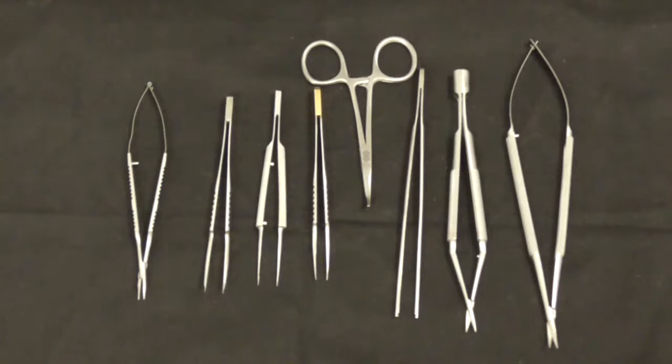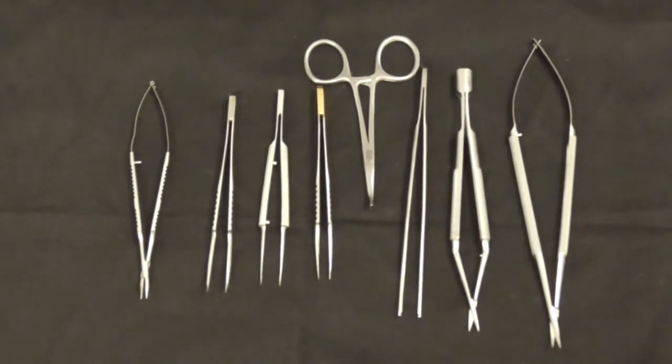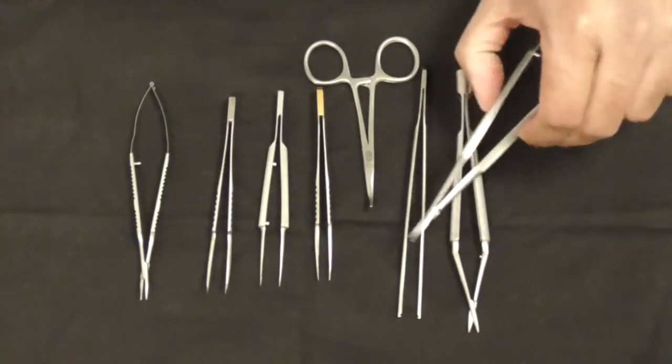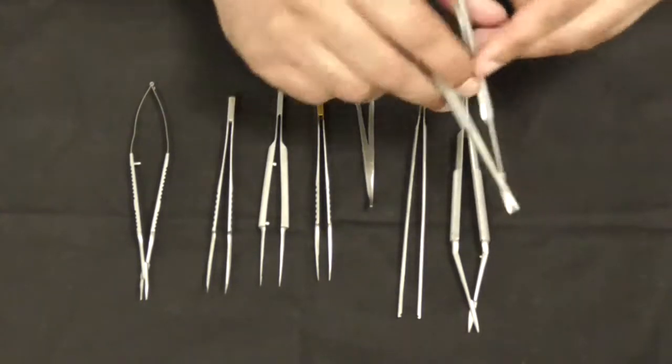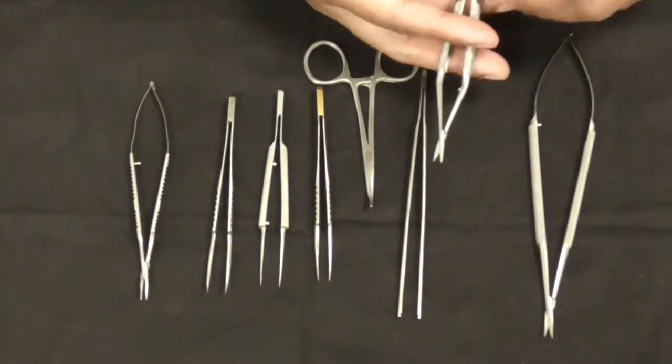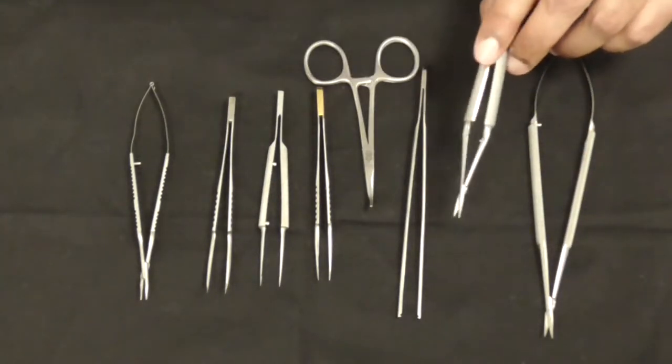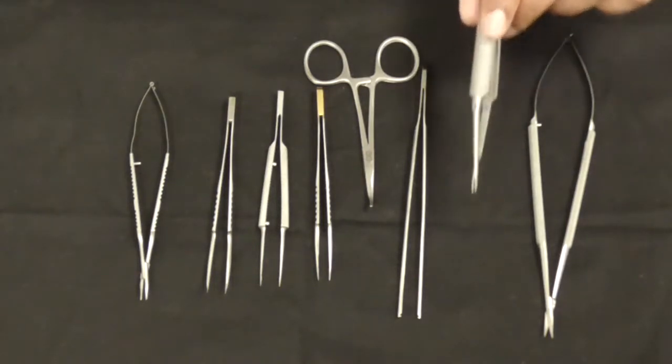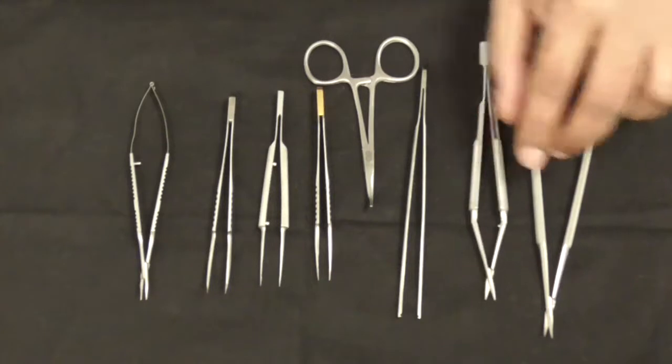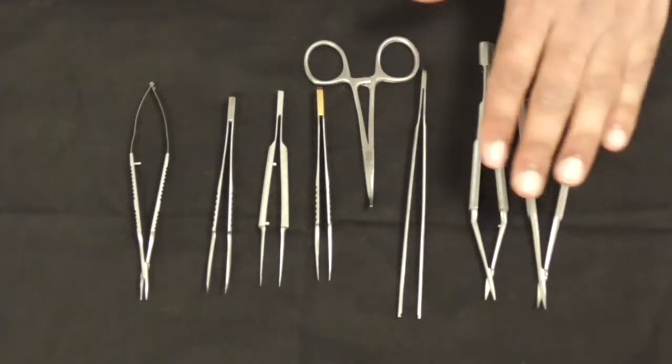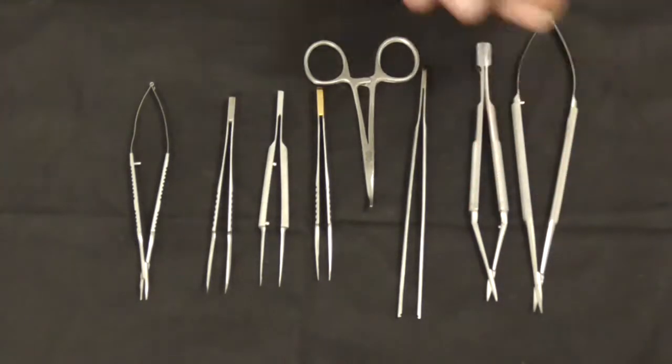We've got the curved scissors, which are used for tissue dissection. The straight scissors are used mainly for suture cutting or cutting the vessel themselves. You get a nice straight cut. The curved scissors are more used for getting rid of adventitia, but there are two kinds of scissors and you've got to use them in the appropriate manner.